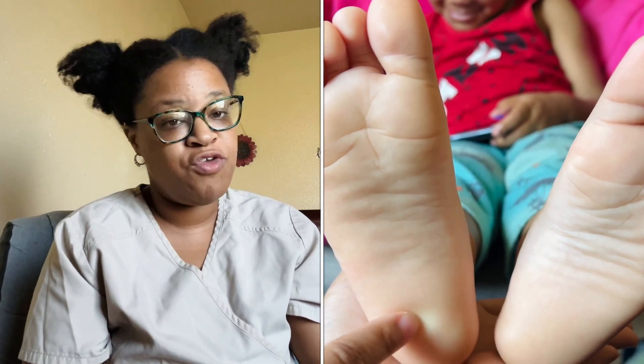The dimensions of your lancet should be no more than two millimeters. Going deeper can cause injury, nerve damage, or even go straight to the bone. Lancets are placed on the skin, you press the button, and it sticks — they are retractable, so one stick and you throw it away into your biohazard container. Always check if the baby has any edema, infection, or heel injuries and notify your supervisor if so.